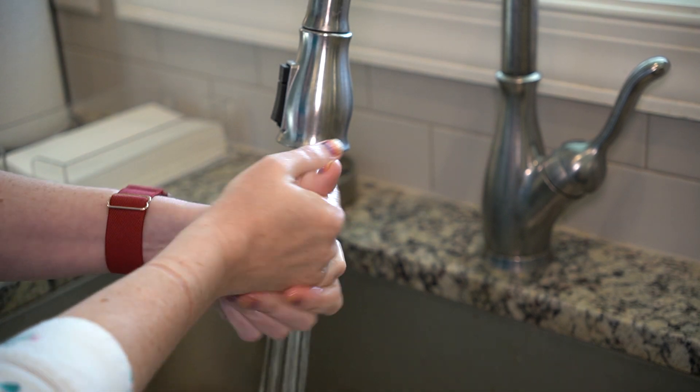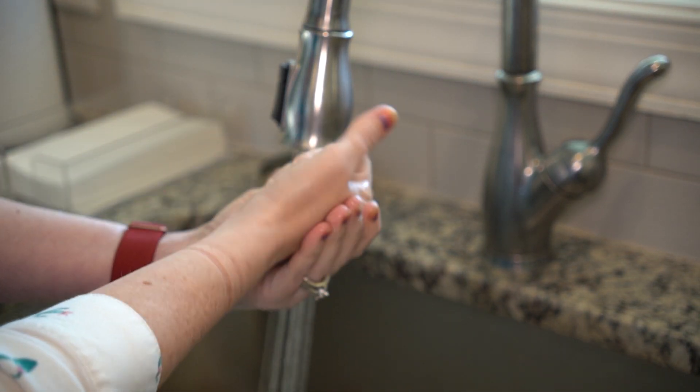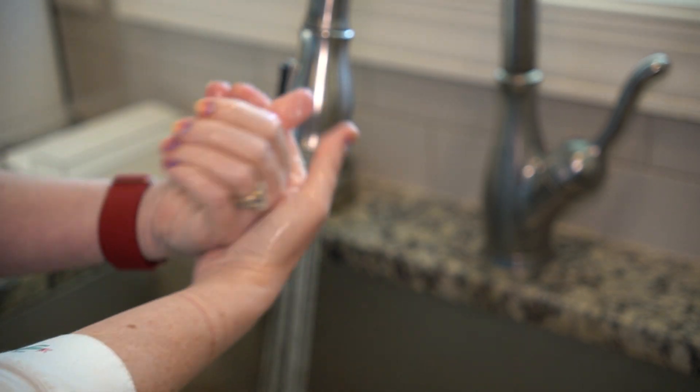Next, you will need to wash your hands thoroughly with soap and water for at least 30 seconds, or you can also use hand sanitizer and rub it into your hands for 15 seconds.